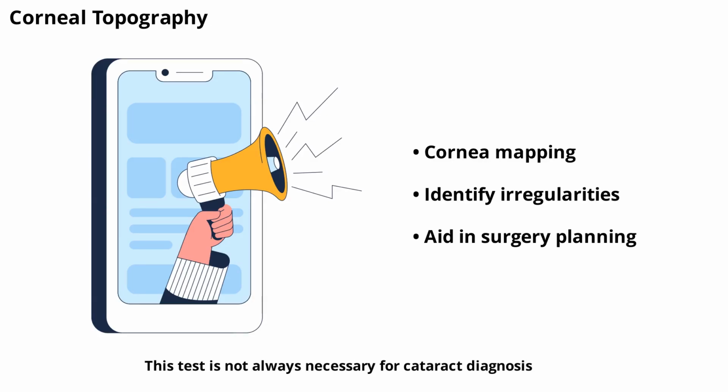This test is not always necessary for cataract diagnosis, but it can be useful in complex cases or when planning surgery. It helps identify any irregularities that could affect your vision or surgical outcomes.